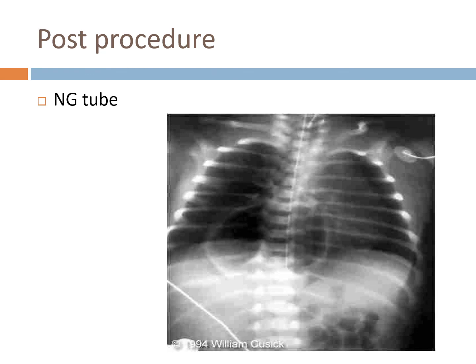But sometimes the NG tubes can go down the wrong hole. They tend to want to follow the ET tube, so you want to make sure that the nurse did not put it into the trachea. If they do, and then they hook it up to suction, you're not going to get your tidal volumes back. Sometimes they get coiled up, as you can see in this one. Sometimes they just get coiled up in the back of the throat, so always good to make sure the tube's in the right place.